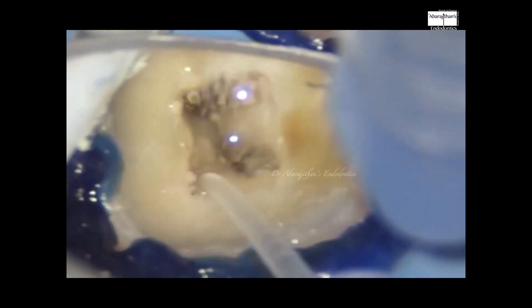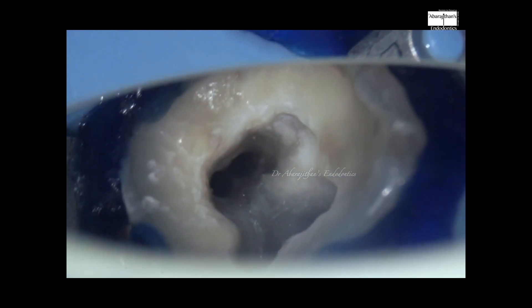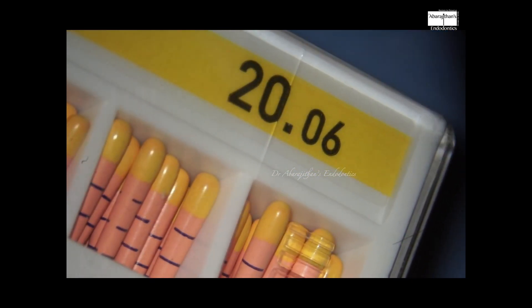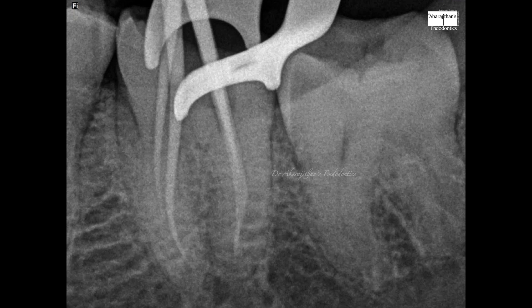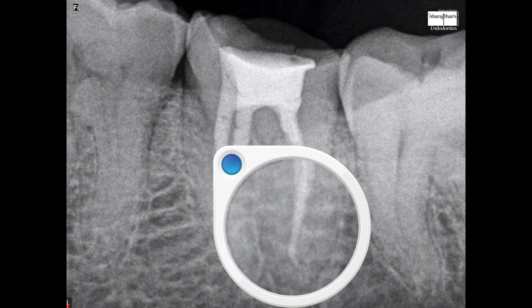After debriding the canals well, you can see nicely clean canals and the pulp chamber beautifully cleaned. The same 20/0.06 GP is used here as well for the master cone. In mandibular second molars we need to be really careful with length control because the mandibular canal is very close to the periapical region — we cannot overshoot. With a controlled obturation technique, we made sure nothing went beyond. Though not a highly curved canal, for a file used for the third time without fracture and with a multi-planar curve in the distal canal, it is a difficult case.